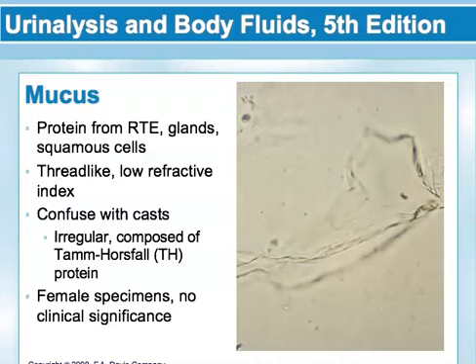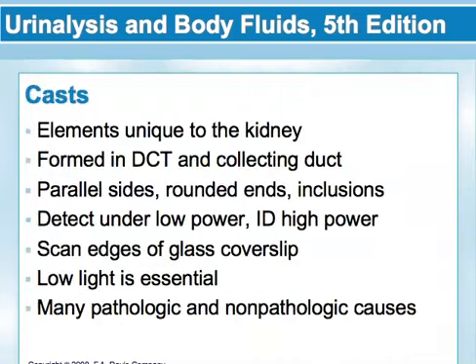Finishing out the Unit 3 lecture, we're going to continue on with the formed elements in the urine sediment. So picking up at casts. Casts are the only element found in the urinary sediment that are unique to the kidney.